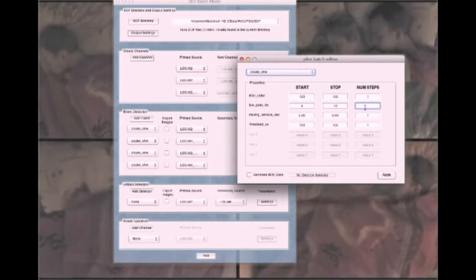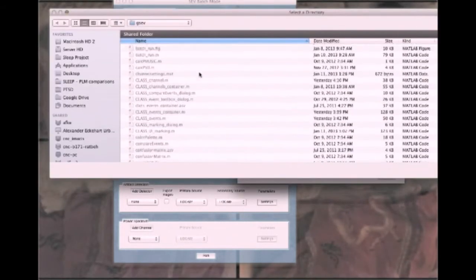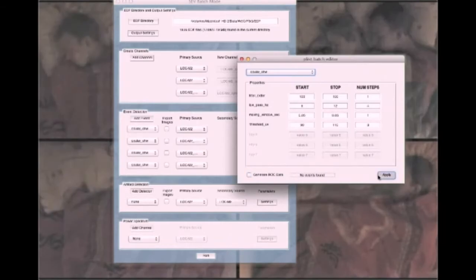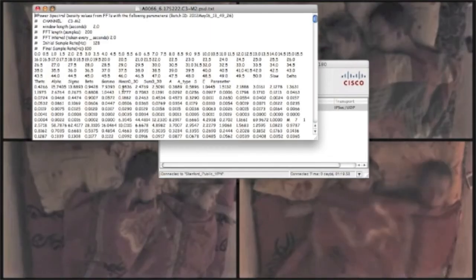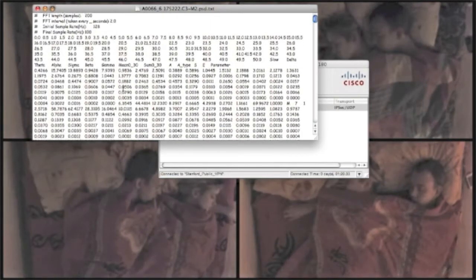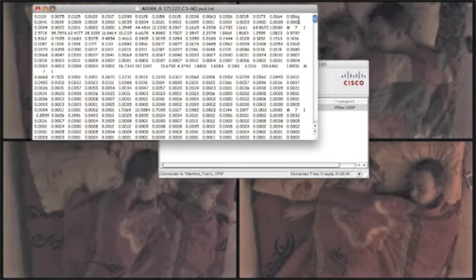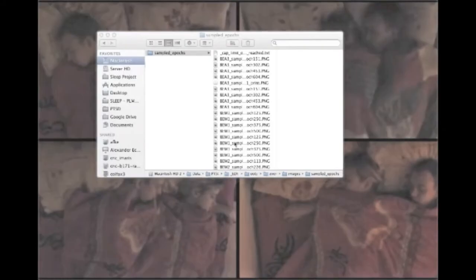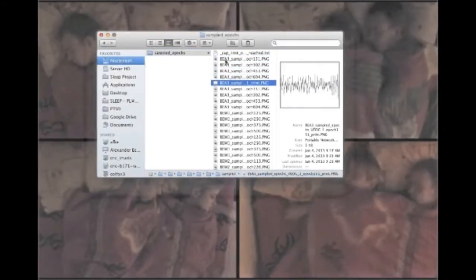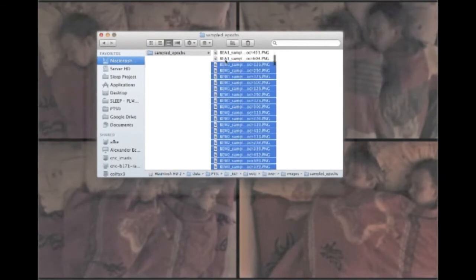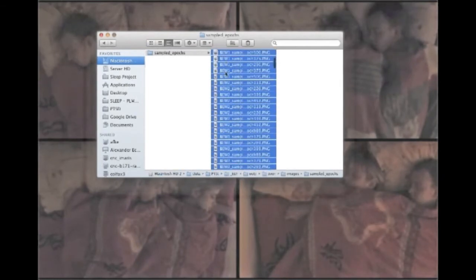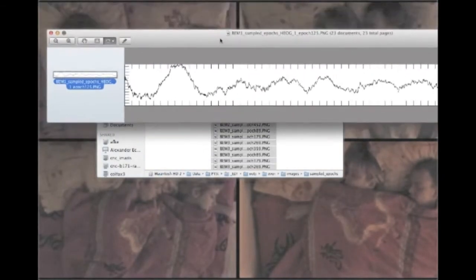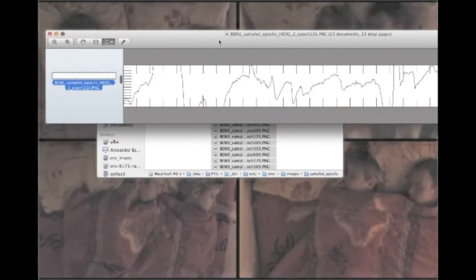Selecting a gold standard dataset lets users determine sensitivity and specificity tradeoffs of different configurations. Output formats include tab-delimited text file, MySQL database entry, or even screen captures of detected sections of data. A simple viewer can be used to quickly observe a detector's performance on any or all studies.